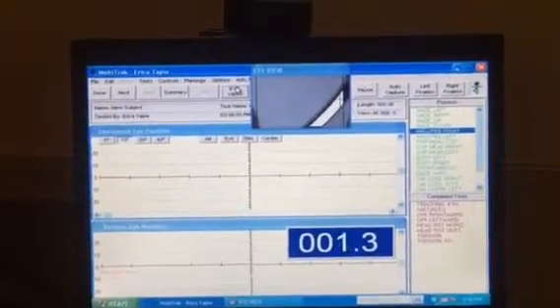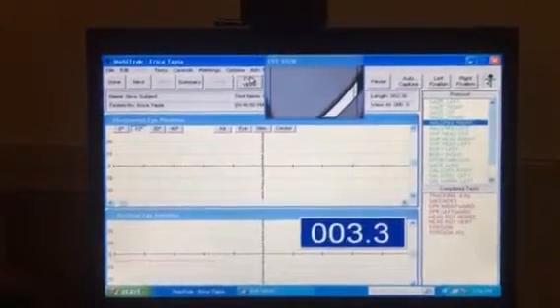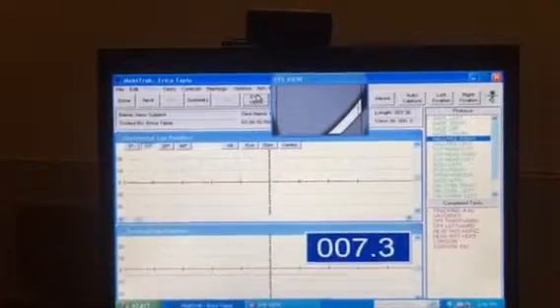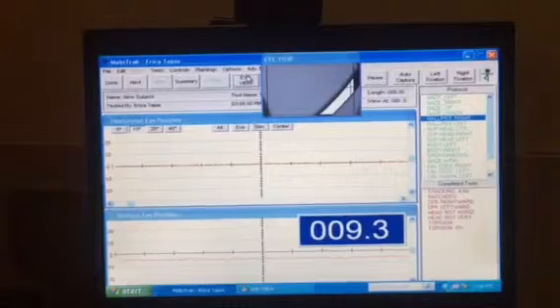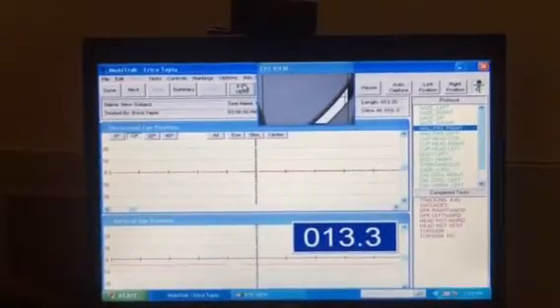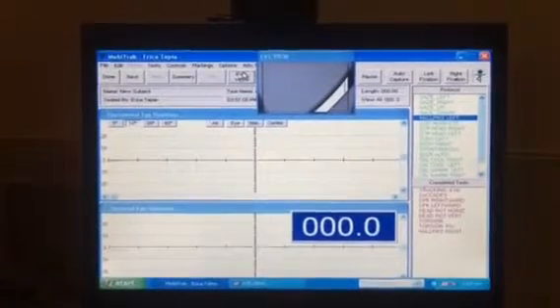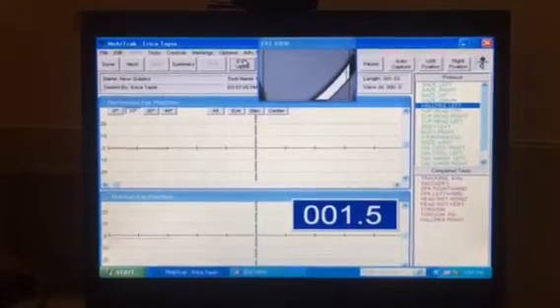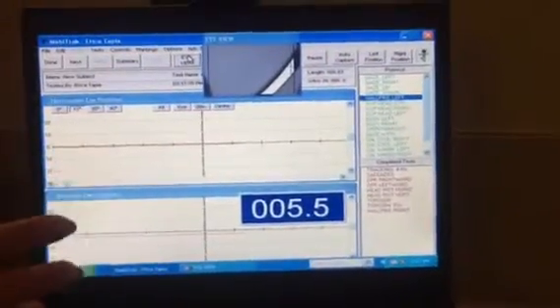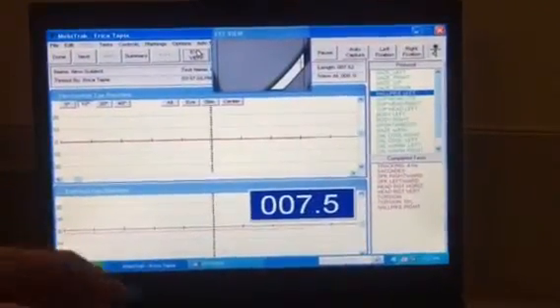Next test is called Hallpike. Remember your little cartoon figure where you're upright, turn the head to the right, go back quickly, make sure that the head is lower than the shoulder. Then they sit up for 30 seconds, make sure they're not dizzy. And then you're doing the Hallpike left. Turn to the left, lay back quickly, hold their head, help them down, make sure they don't have any neck strain.